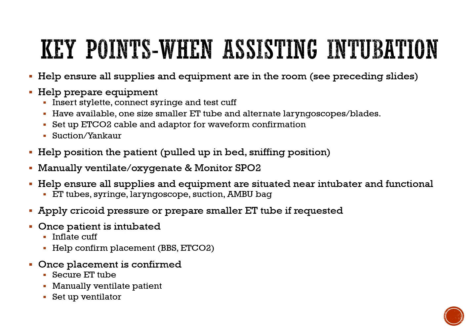What I also do when I'm testing the cuff is I'll also pull the cuff back slightly. So I want it tapered backwards because it's an easier passage through the glottis than if you have, if you will, kind of a plunger type effect. It's just, I believe in taking every reasonable advantage that you can, and that's one of them. And you have to test the cuff anyhow.